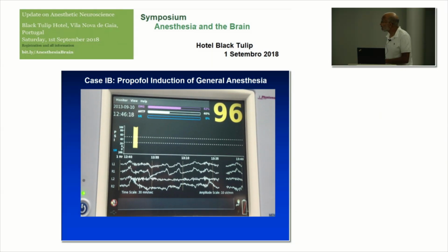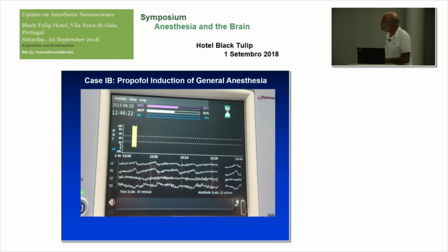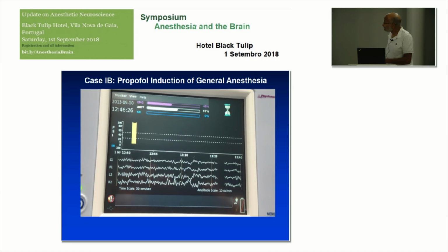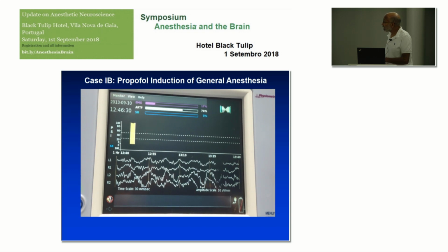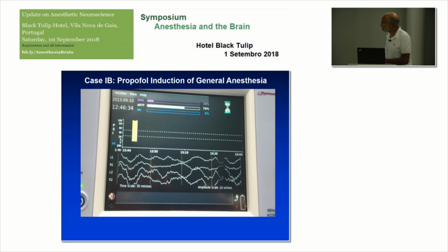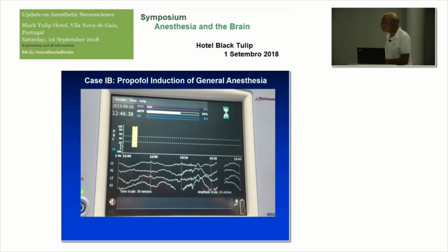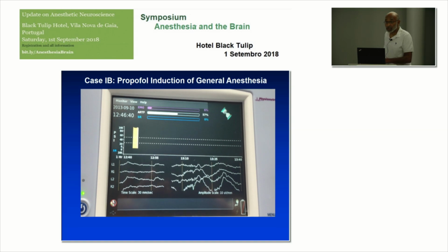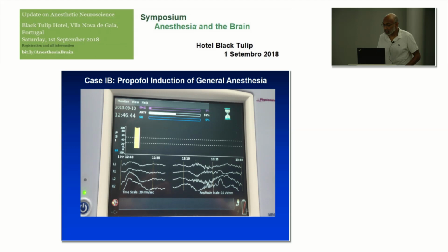Watch right here. So right now, boom. See those beta oscillations starting? Now, large, slow oscillations, all right? Even bigger. And now watch what happens. Burst suppression, all right? So very deep, very quickly, all right? So let's just go back and look at this now.